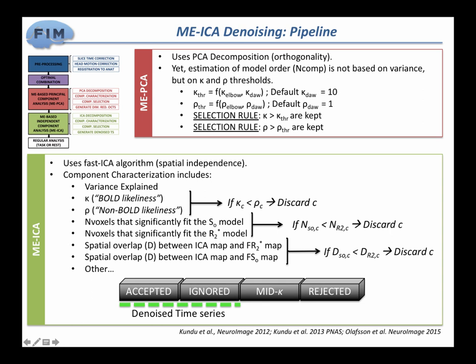And I know this sounds very vague, and that's why you need to look at your results. I mean, it really does a good job. It really allows you to denoise the data in a more strict way than you would normally do, but you have to make sure that the algorithm doesn't throw away your task, or keep a huge drift in when you can actually remove it, okay?